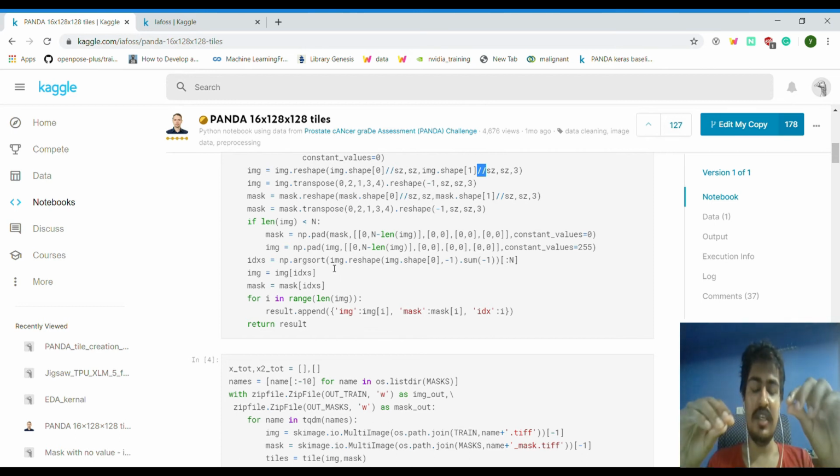So when we are talking about having more white patches, correspondingly if a patch has more white spots, its total sum is going to go higher because white is of value 255 cross 255 cross 255. So the value is really high compared to other color values.